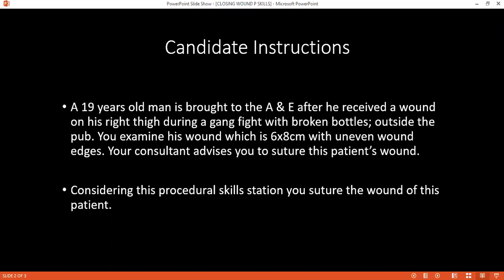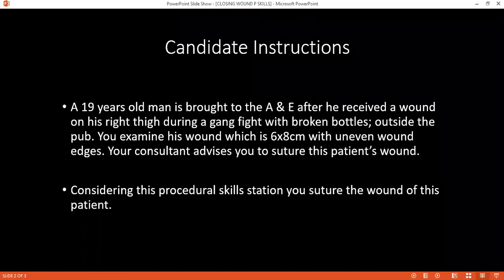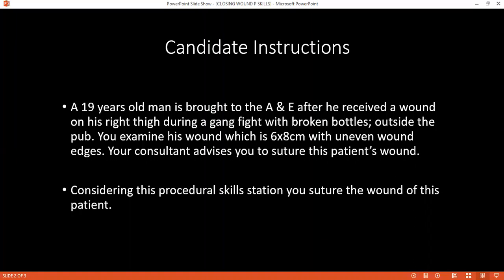I will calculate the required dose of lignocaine. I will sensitize the patient — I will try to give the local anesthetic to your wound so that your local area will become numb. I will slowly inject the needle into subcutaneous tissue, draw the plunger to check I am not in a vein, then slowly infiltrate the area. I will wait three to five minutes for the local anesthetic to take effect.